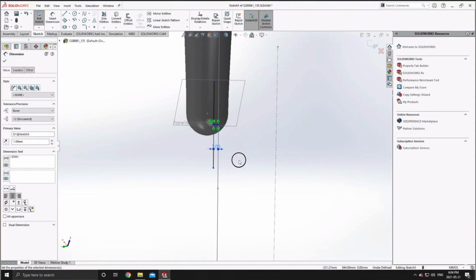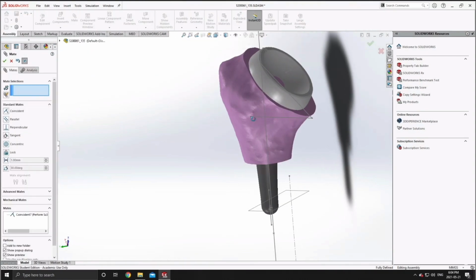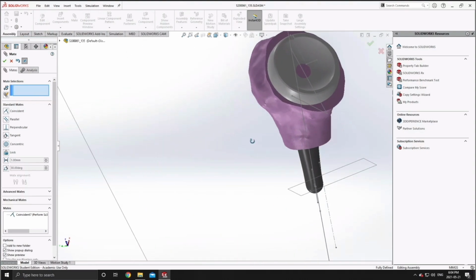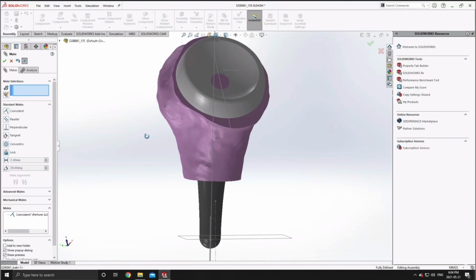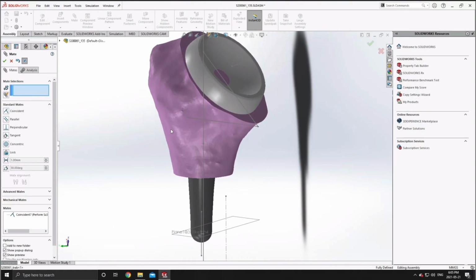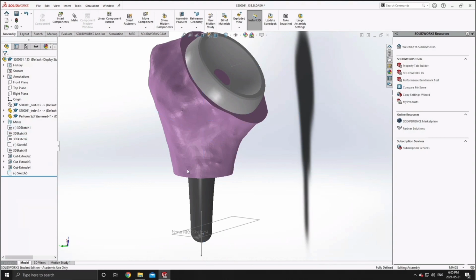Now, as you can see here, I've set a 1 millimeter eccentricity from the center of my humeral stem to the long axis of the humerus, and this convention will be applied to all positionings of my master implant in subsequent patient models. Now, implant positioning is a relatively quick process after you determine your resection plane and all of your initial anatomical landmark directions and axes.